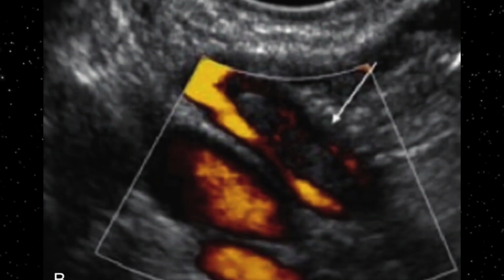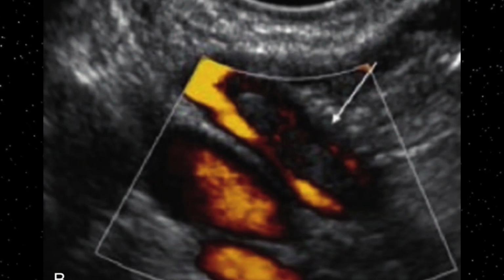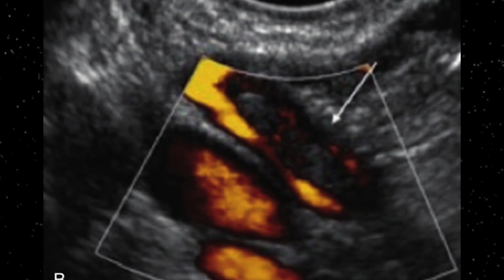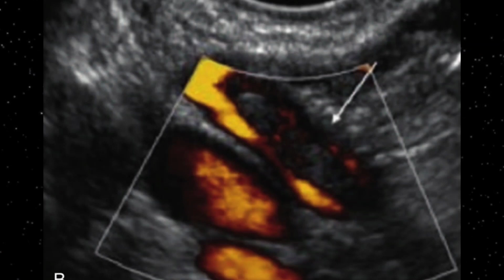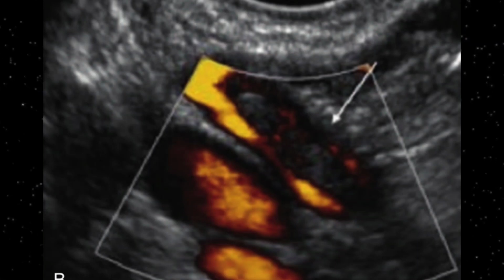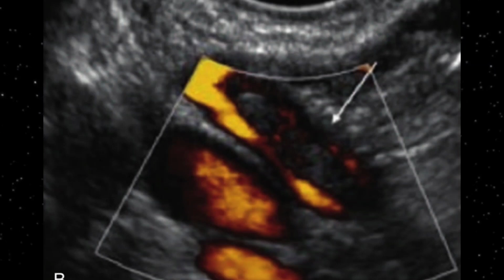This is the same patient, and another separate view has been shown, and the Doppler signal has also been shown to visualize how much of the lumen of the ovarian vein is occluded. Here you can see to some extent there is sluggish, partial flow in the peripheral part of the lumen. However, centrally it is occupied by echogenic thrombosis. Again, this white arrow is indicating the thrombosis region.